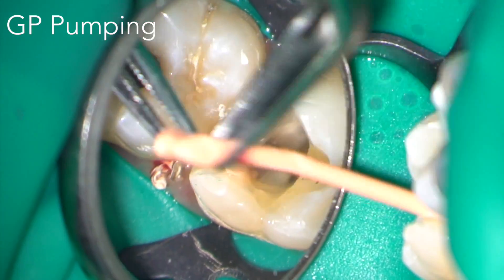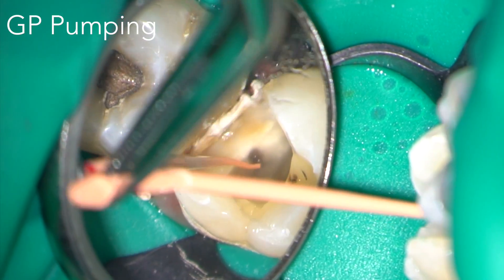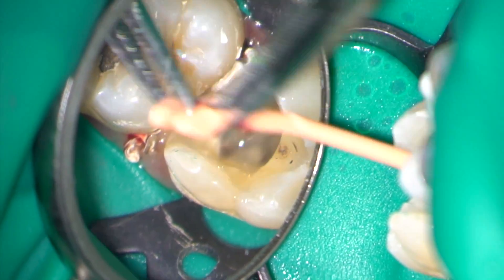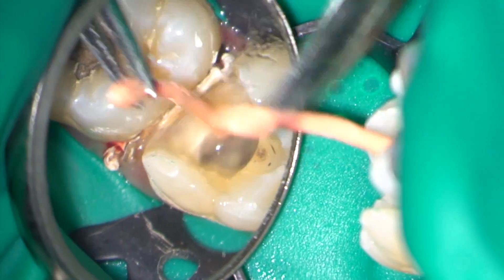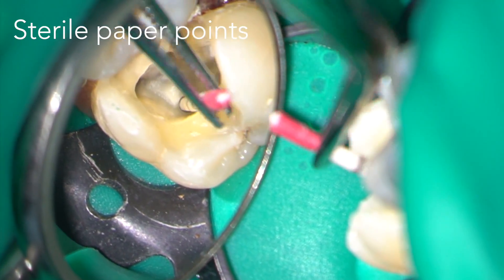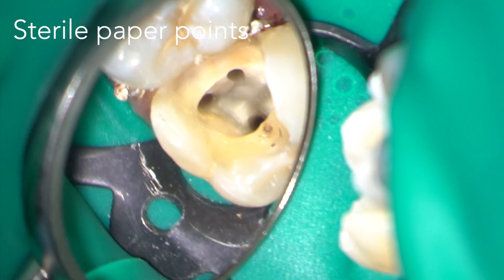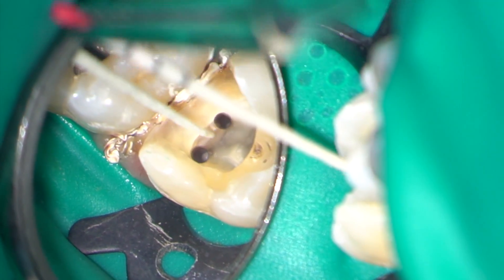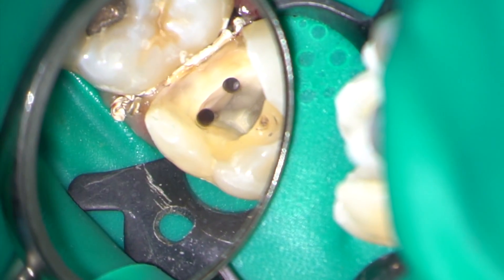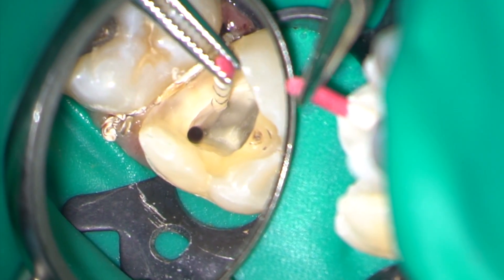GP pumping using a master cone is an effective way of agitating the irrigant in the root canals. I'm now drying the root canals — don't forget you must always use sterile paper points. If you look carefully you can see that I've placed some PTFE tape mesially; there was a little bleed in the gingiva and this is an excellent way of stemming any bleeding.